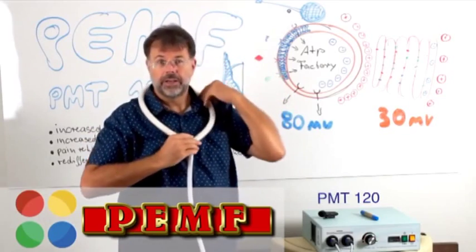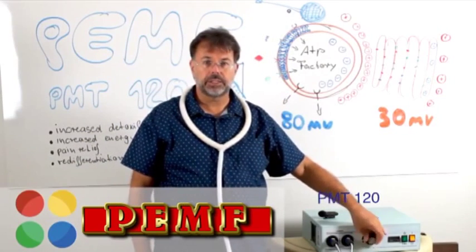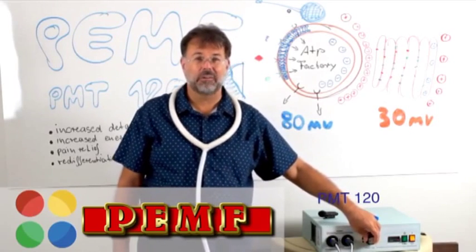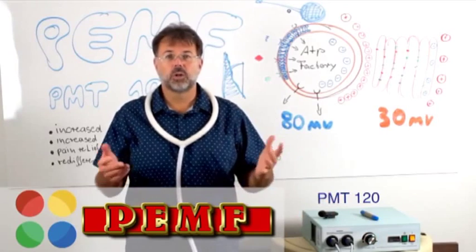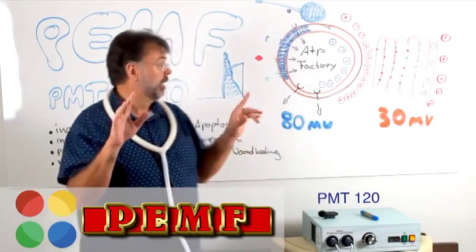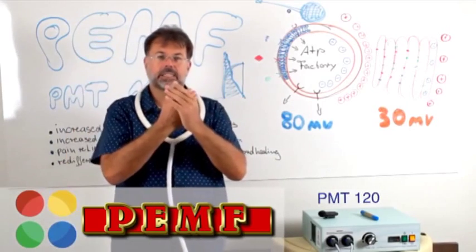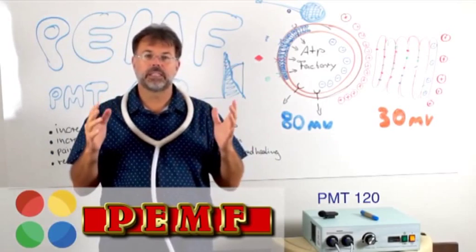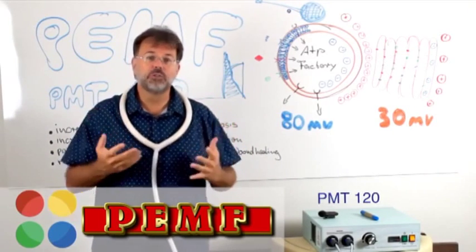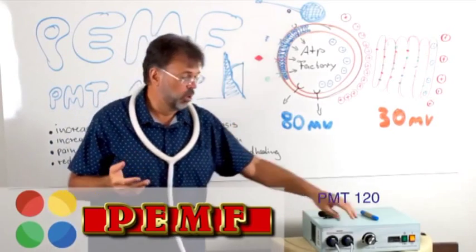Then you bring it down, and you can put it around your thyroid. And let's just bring it up. You can see this thing, and that's probably just half, actually really causes massive contractions, muscle contractions, spikes that go very sharp, hit the cell, and vibrate everything loose. So when you start the treatment, you don't want to overdo it, because you can have a massive Herxheimer reaction.